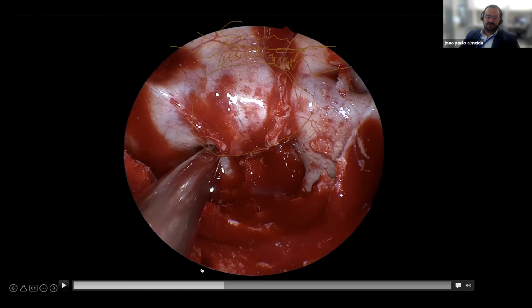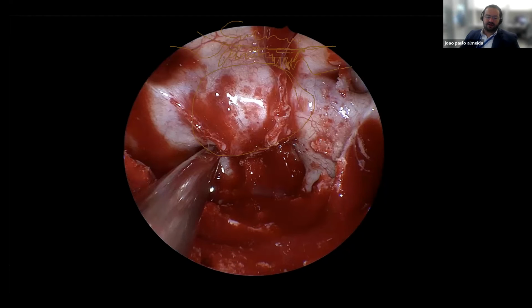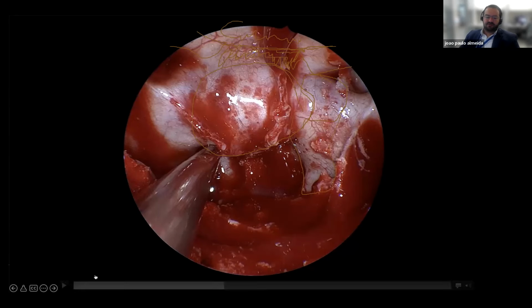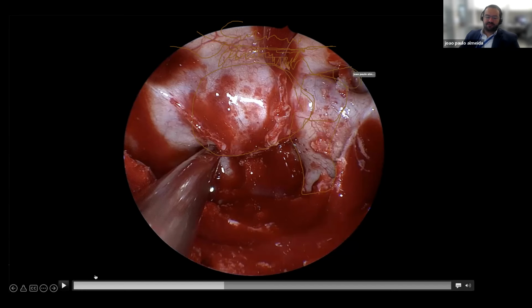So here, once you identify those points, you're going to look laterally and you're going to find the red thing, which is the carotid, the paraclinoid carotid, or I call that the clinoid segment of the carotid, just in reference to the transcranial approach. What you see curving down here then is the paraclival ICA, or the ascending segment of the carotid as it goes into the cavernous sinus. And all this area here would be the anterior wall of the cavernous sinus. This is called the lateral optic carotid recess, which separates the optic canal with the optic nerve and the superior orbital fissure, which is right here.